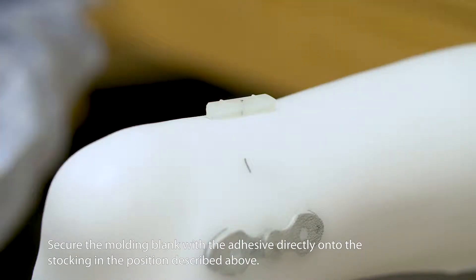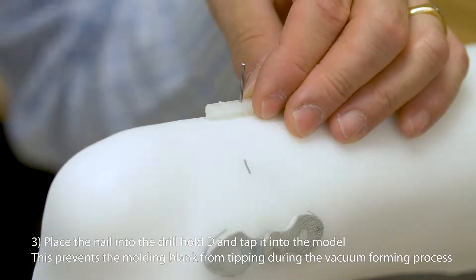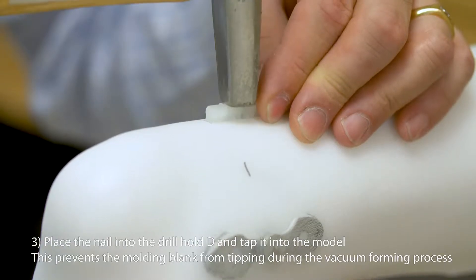Secure the molding blank with the adhesive directly onto the stocking in the position described above. Place the nail into drill hole D and tap it into the model. This prevents the molding blank from tipping during the vacuum forming process.